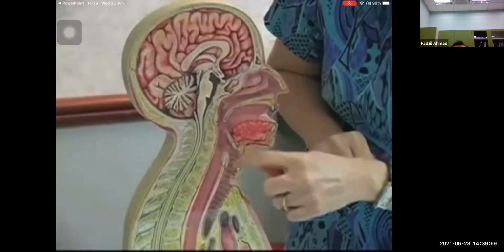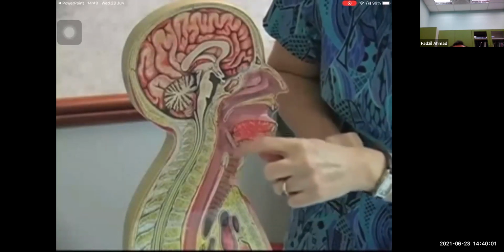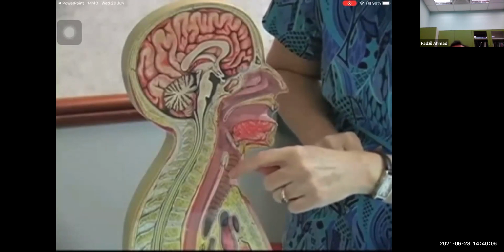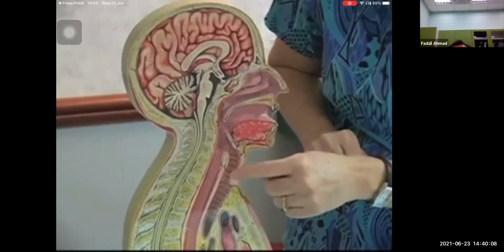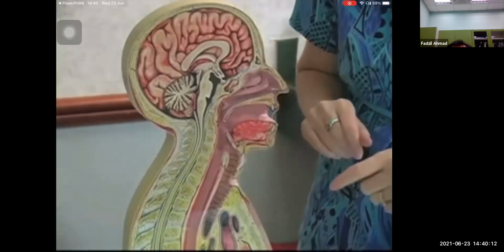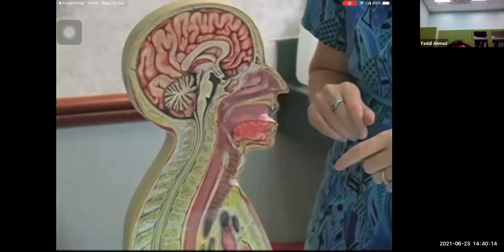This can mean that the tube is trying to enter the breathing passage, so we need to take that tube out. So remember, the signs are coughing, choking, color change around the lips, trouble breathing, keeps gagging or coughing after the tube is placed, or does not seem to be himself. Remember, when in doubt, pull it out.